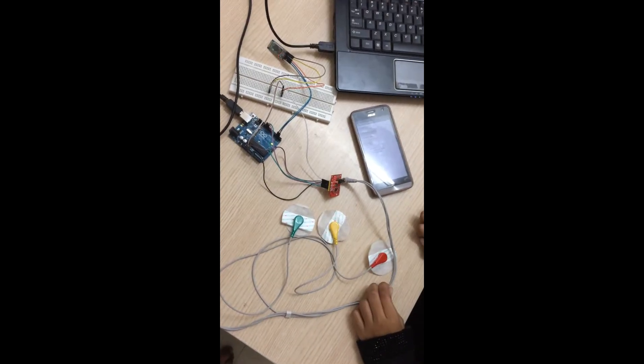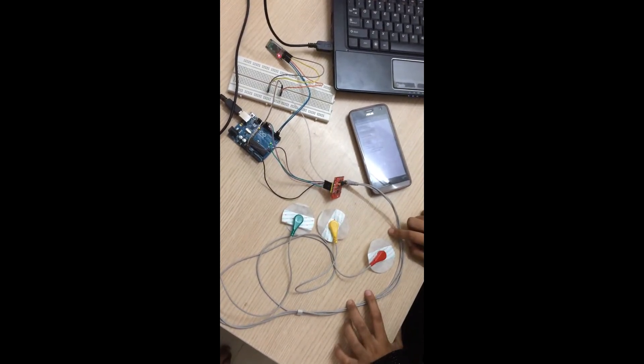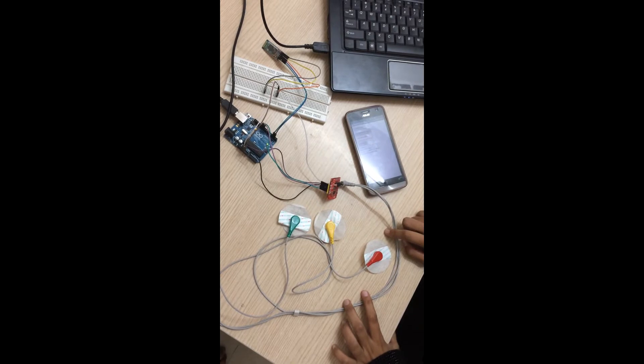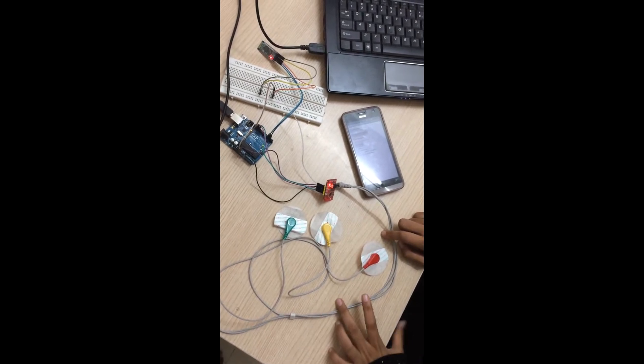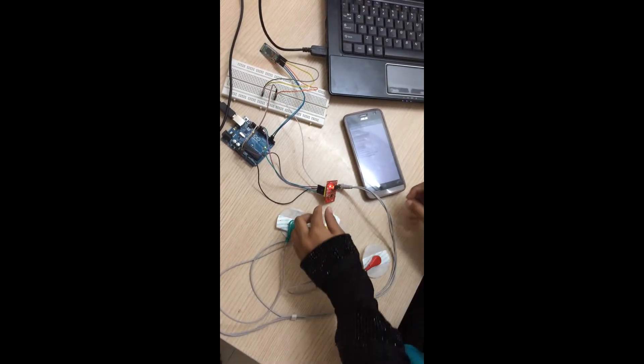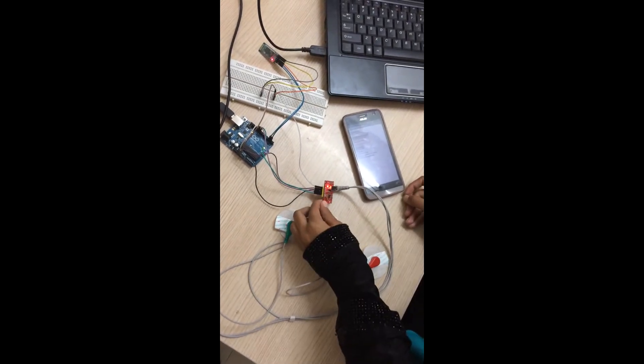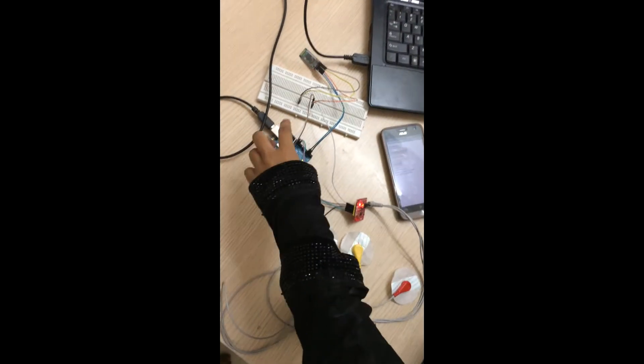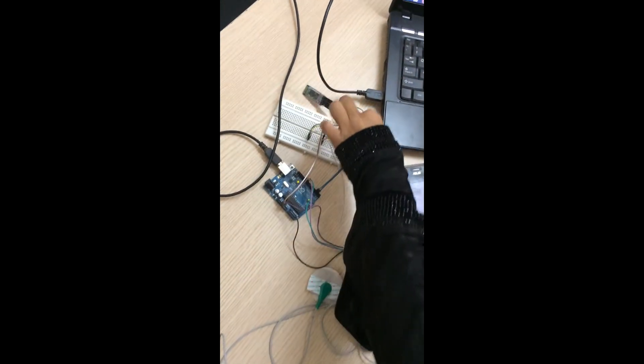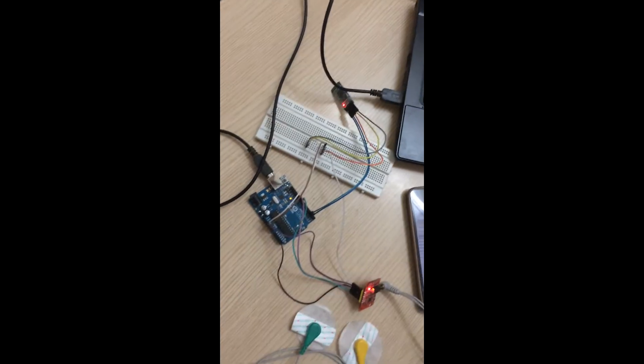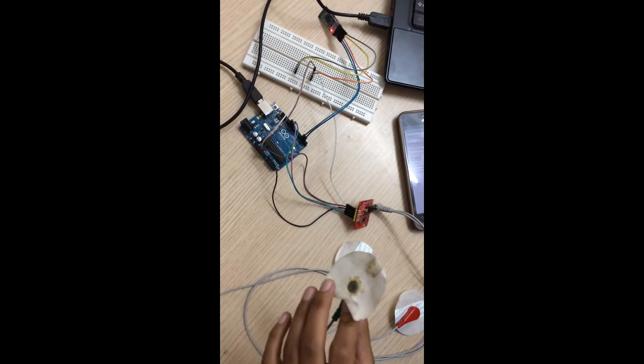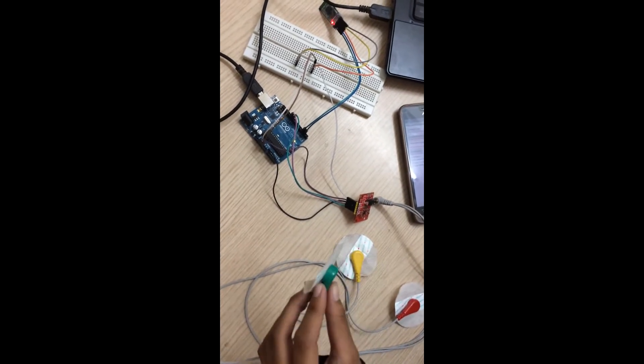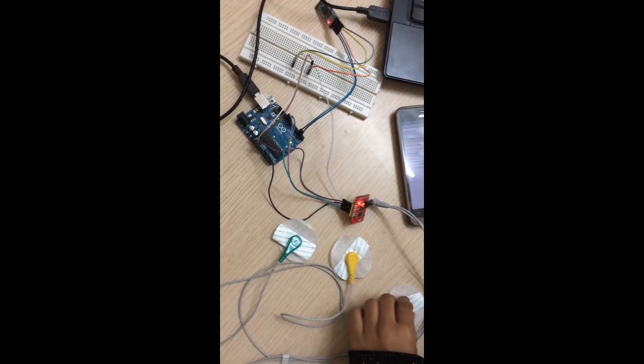Hi all, we are doing a project on ECG and Arduino interfacing via Bluetooth. These are the electrodes which we are connecting to the ECG sensors. This is the Arduino board and this is the Bluetooth HC-05 module. These electrodes we need to connect to the left arm, right arm, and right leg.